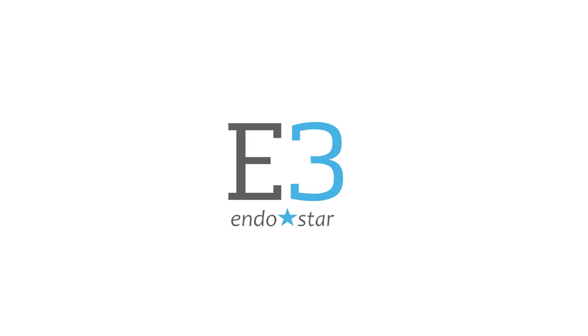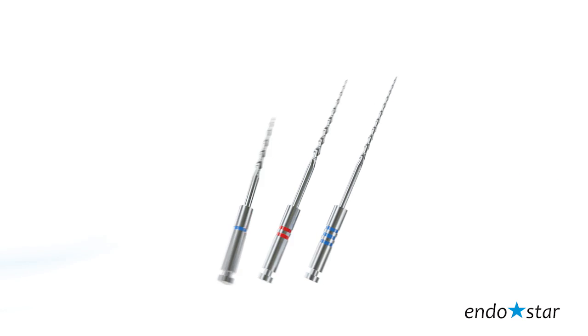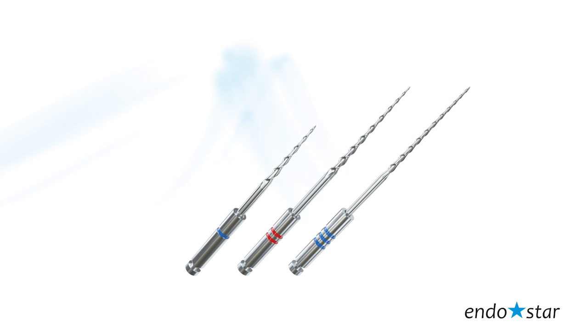The EndoStar E3 Rotary System is an innovative system of rotary files that suits the needs of dentists. The EndoStar E3 Rotary System can be characterized by three features: easy, efficient, ergonomic.